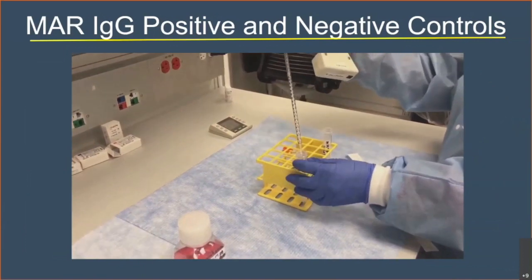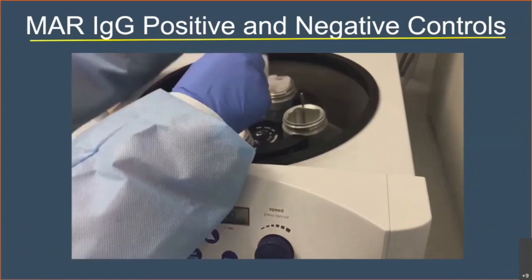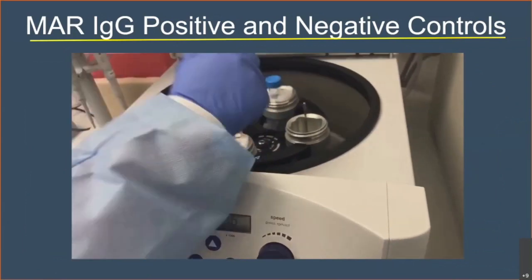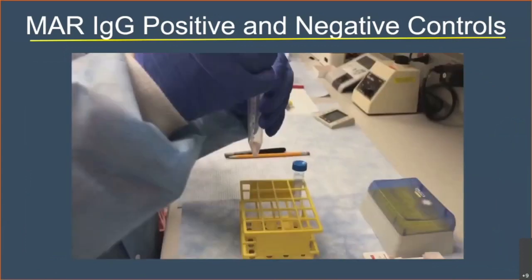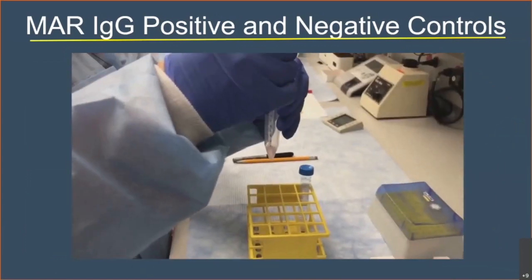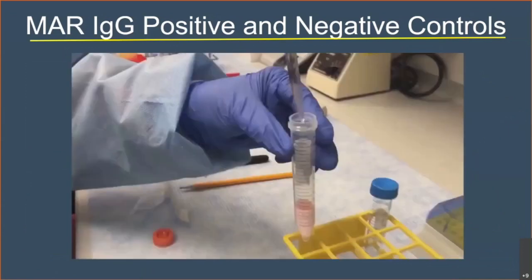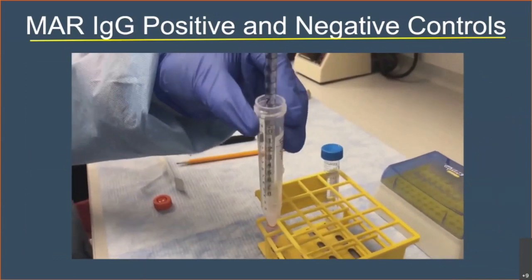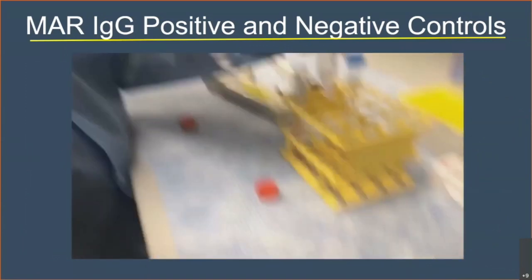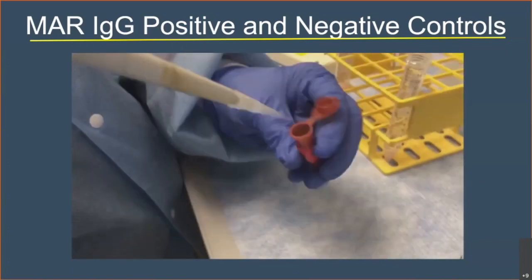So here, the semen sample from the donor is there, and then modified HTF is added, twice the volume. This mixture is placed in the centrifuge for 10 minutes. The aspiration of the supernatant is done. The pellet is left undisturbed. And then the pellet is reconstituted with some more fresh modified HTF, and the concentration should not be higher than 50 million. So this is the positive control.